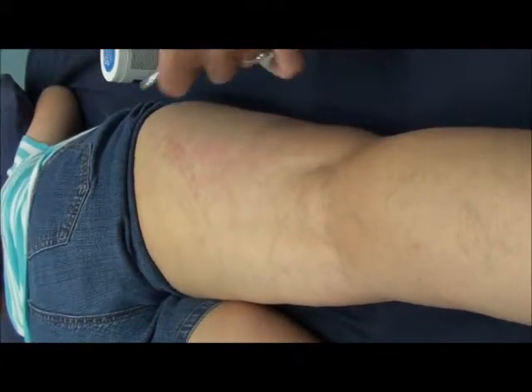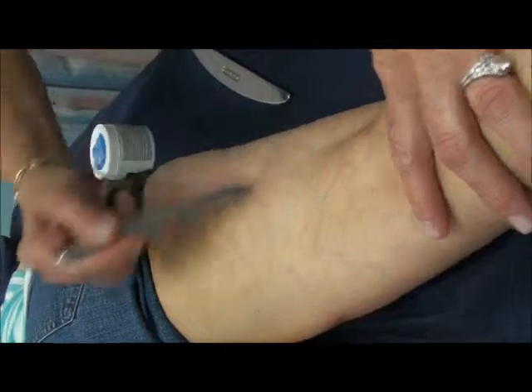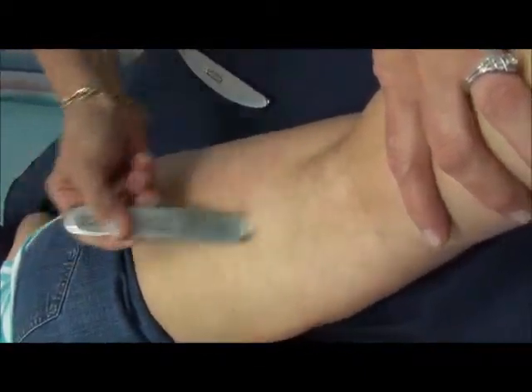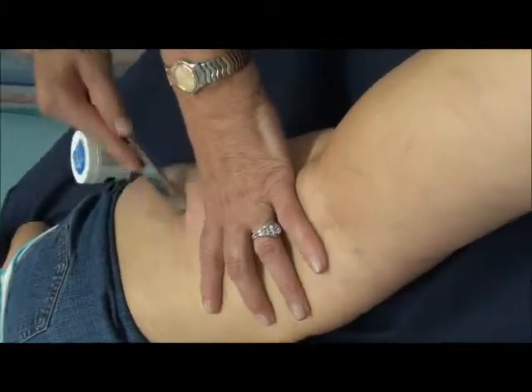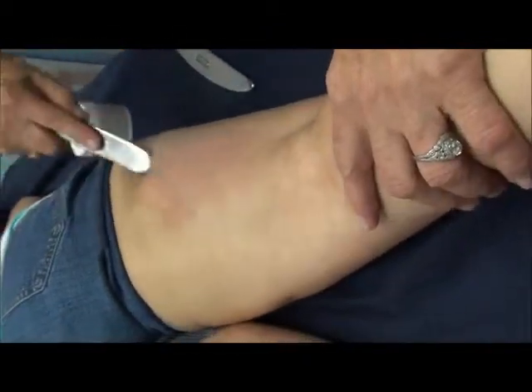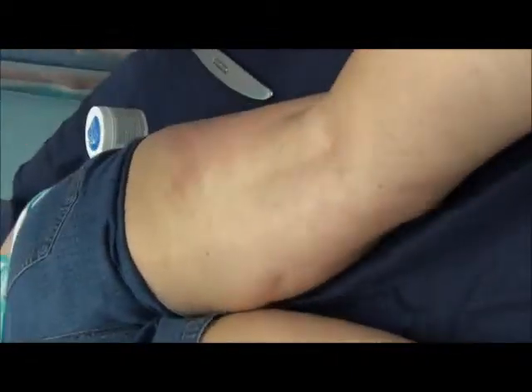After I use that instrument, I then can take what looks more like a butter knife, and I can come in here and go horizontal to the muscle, vertical to the muscle, and even diagonal. And you can see she's turning quite red, and she has something right there.